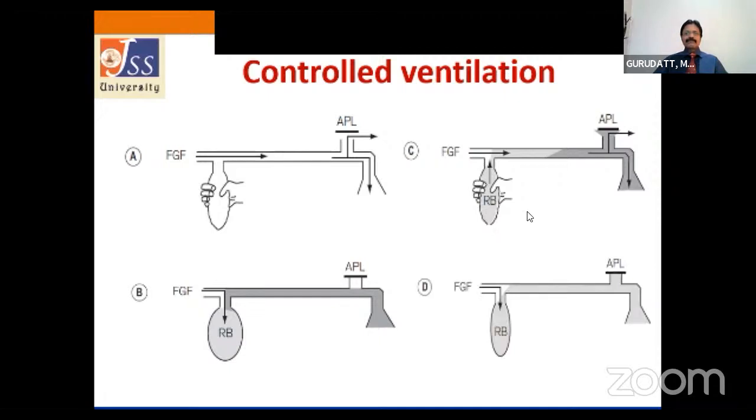That means with controlled ventilation, the patient can have a lot of rebreathing of the carbon dioxide containing alveolar gases. So even though we may have to keep 3 times the minute ventilation for controlled ventilation with Mapleson A, still there may be rebreathing of carbon dioxide. That's why it's the worst circuit for controlled ventilation.